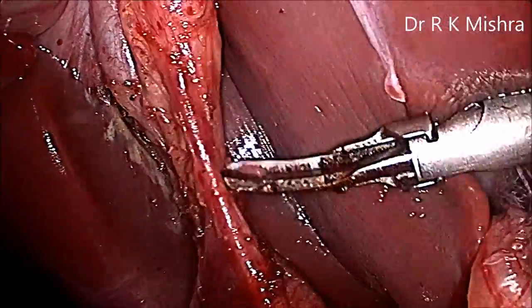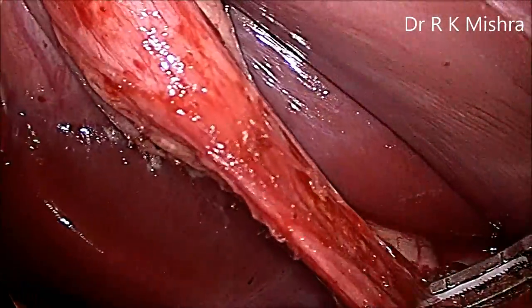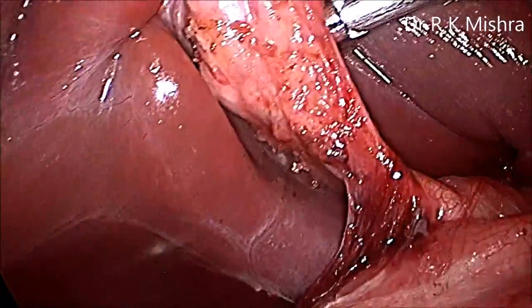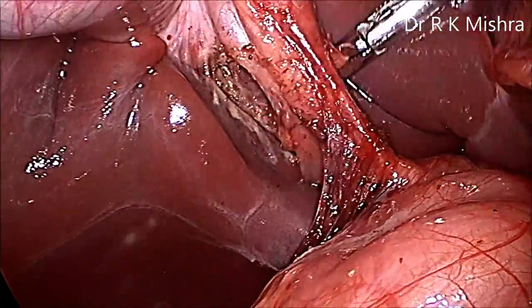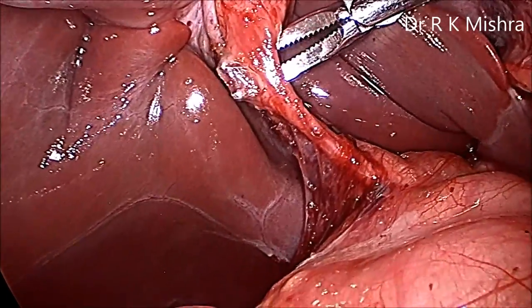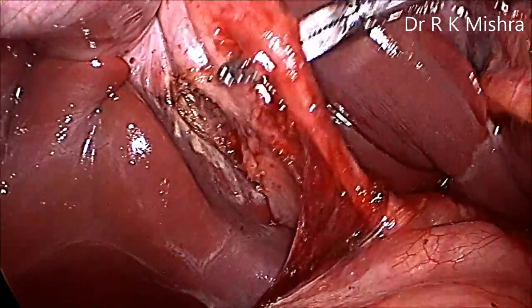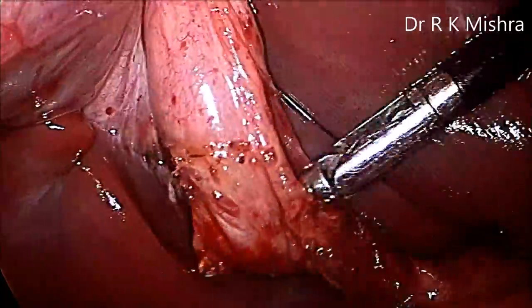Stripping of the peritoneum is carried out to create anterior and posterior windows. We prefer the Maryland dissector because the harmonic jaw is sharp — the convex edge of the Maryland is kept towards the liver. Open slowly to make the posterior window. The Maryland jaw is 22 mm, so once fully opened the posterior window is created. Then make the anterior window. This is the cystic artery and below is the cystic duct; make a window between the artery and duct using the full jaw of the Maryland — 22 mm.